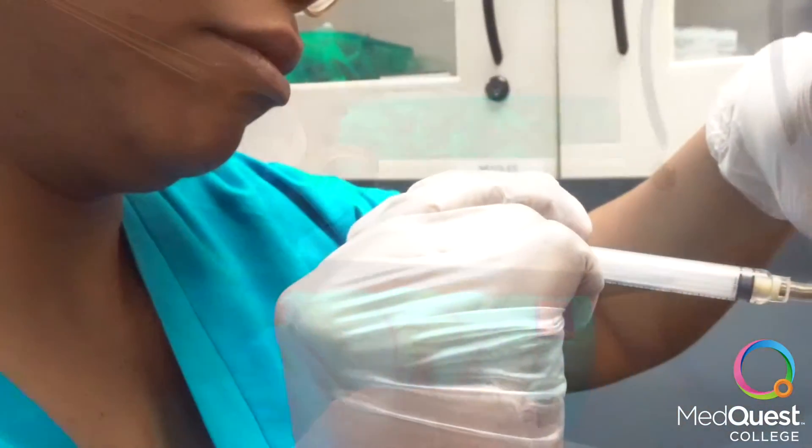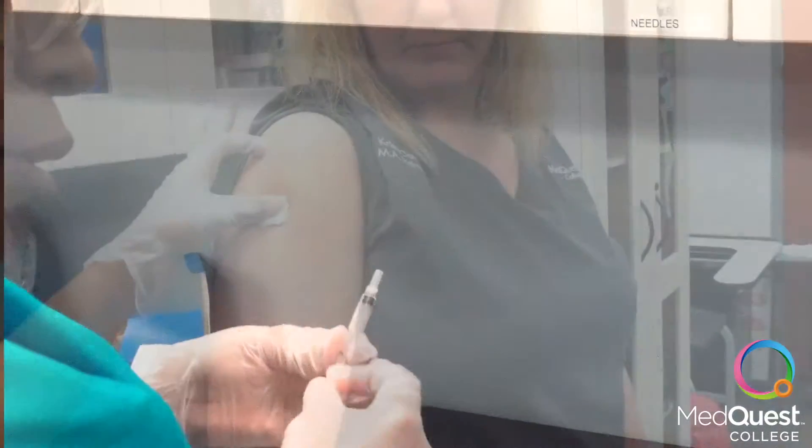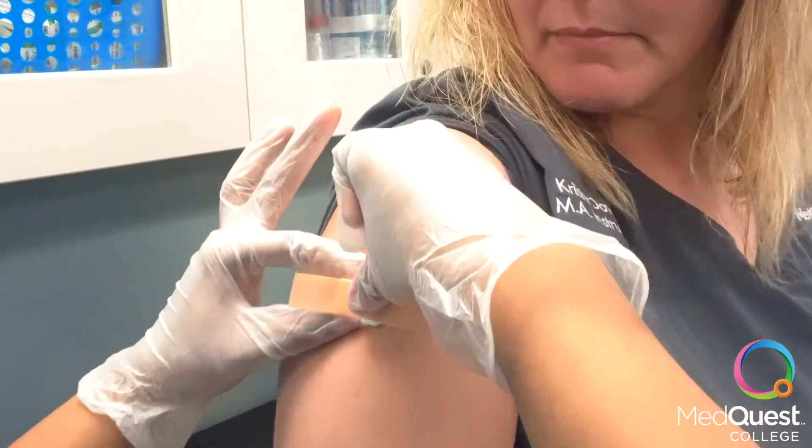Remove needle from arm. Activate safety on needle. Bandage your patient and dispose of syringe into the Sharps container.